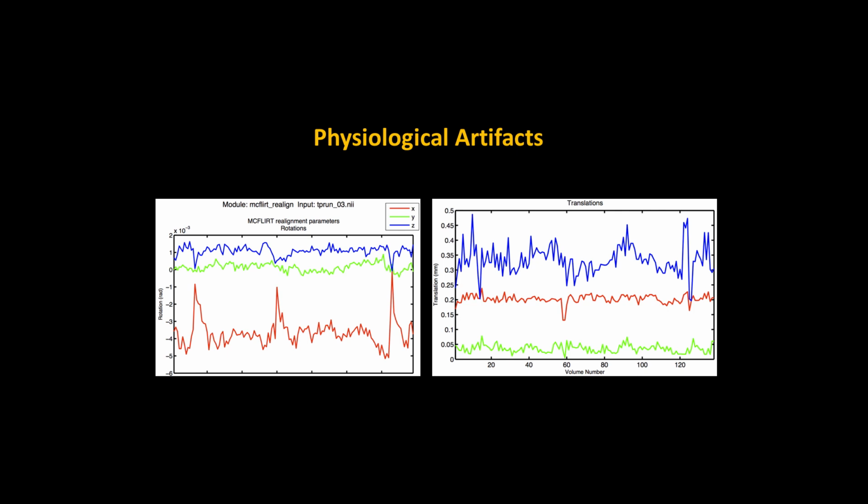To give you the most clear example, if you're doing something such as resting state, people have much stricter thresholds for what constitutes a motion problem than not a motion problem, right? In resting state, if people move, that can induce things called spurious correlations, which, because correlations are usually the whole point of a resting state analysis, that's something you can't have in your data.